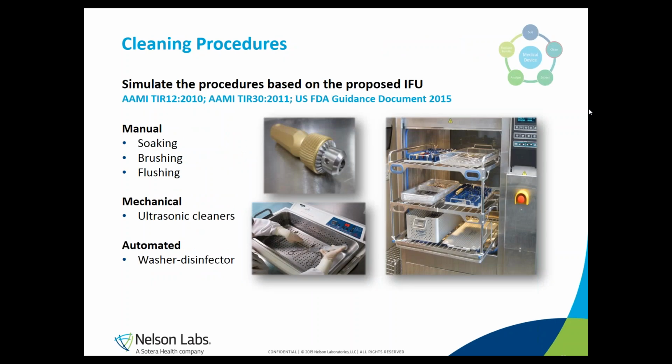Cleaning of reusable devices can be performed in a manual, a mechanical, or an automated way, or even a combination of all these techniques. The technique that is chosen is highly dependent on the properties of the medical device itself. For example, manual cleaning steps may include soaking, brushing, or flushing.